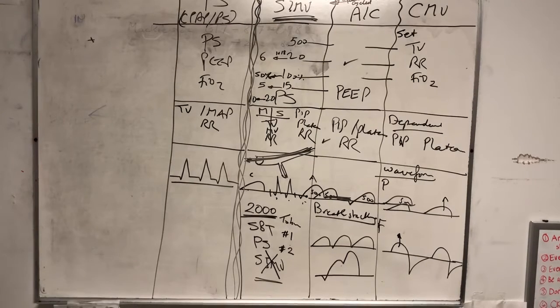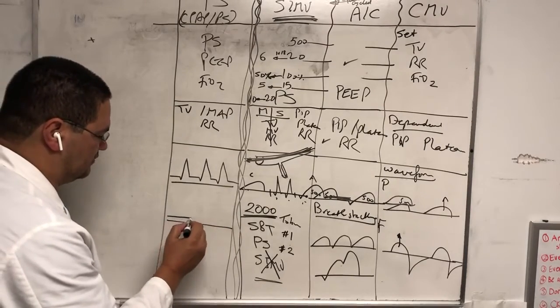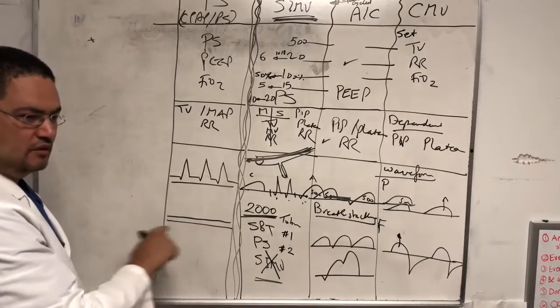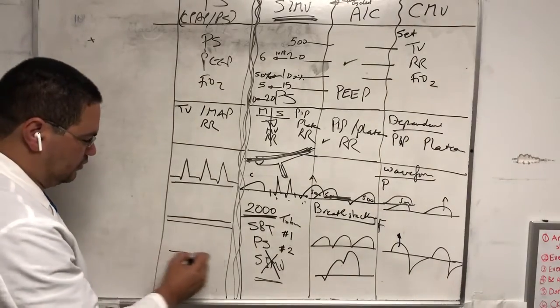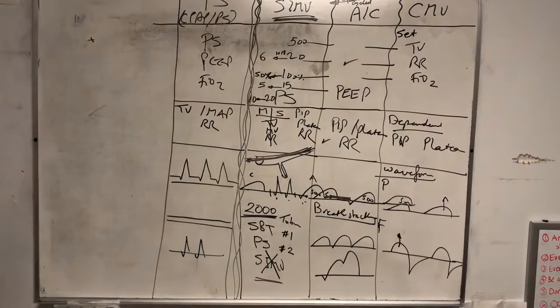Because nobody will put CPAP alone. CPAP is like this. This is continuous positive airway pressure. That's CPAP. It's like PEEP. And pressure support obviously is like this. So it is a pressure support carried on CPAP. So that's the first thing. That's a misnomer.